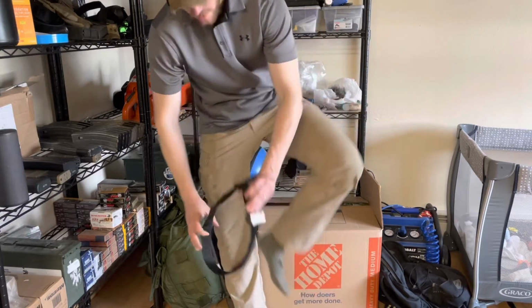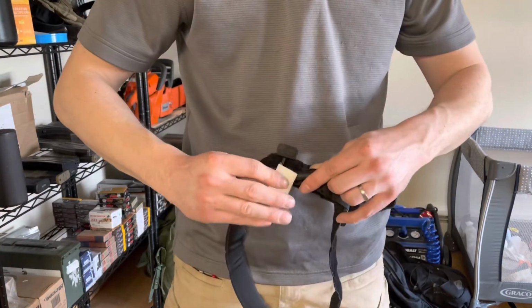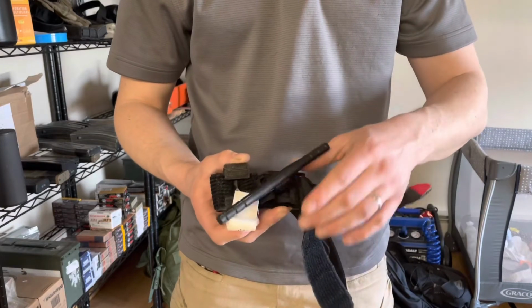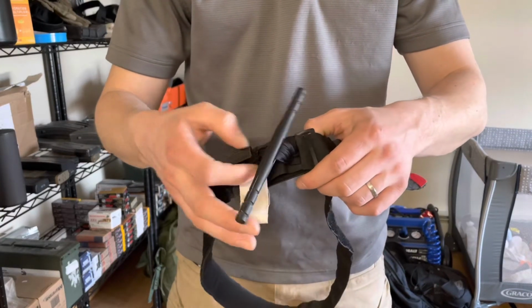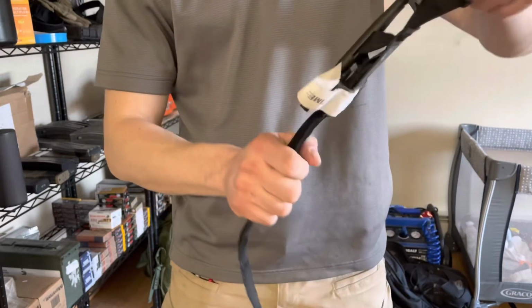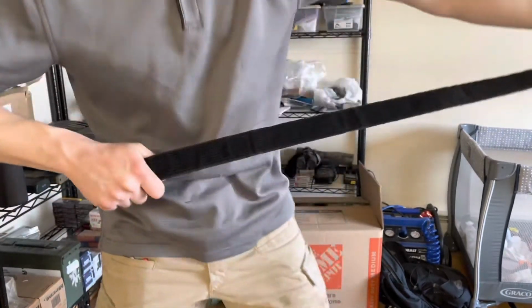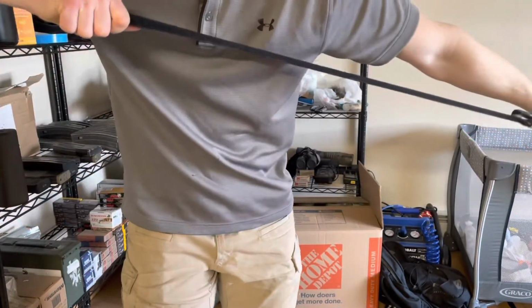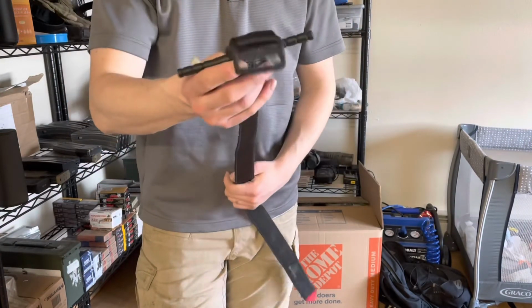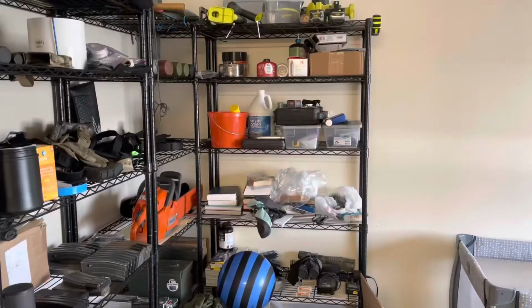Now we'll use this to show you the operation of the inner band. Right here you can see it's all matted up and such, and you can see how the inner band actually came out of its sleeve. And then you can fix that by basically just pulling on the tourniquet from the friction adapter to the tail, and you can evenly distribute that inner band throughout the tourniquet again. But yes, that's self-application on a leg. We'll talk about an arm next.